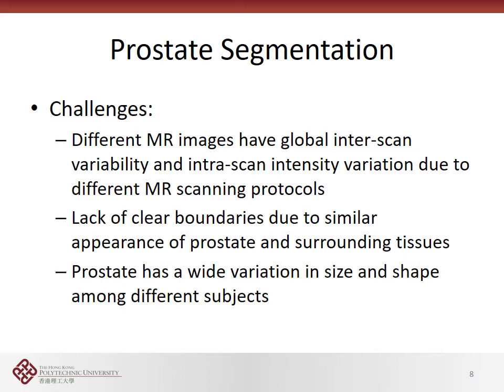Second, in many MR images, there is a lack of clear boundaries due to the similar appearance of the prostate and surrounding tissues. So it's quite difficult to distinguish the boundary between the prostate and the surrounding tissues.